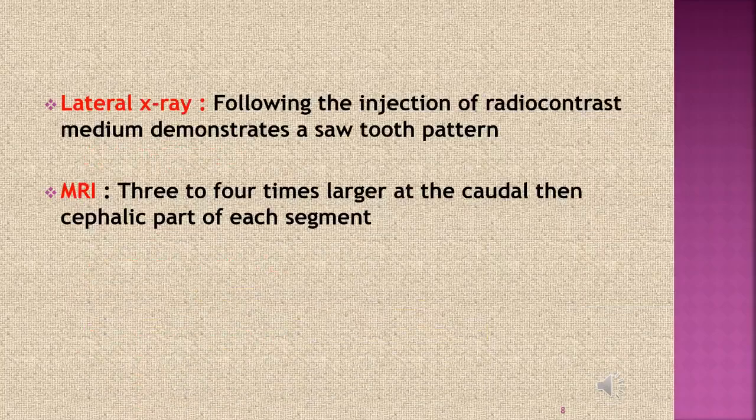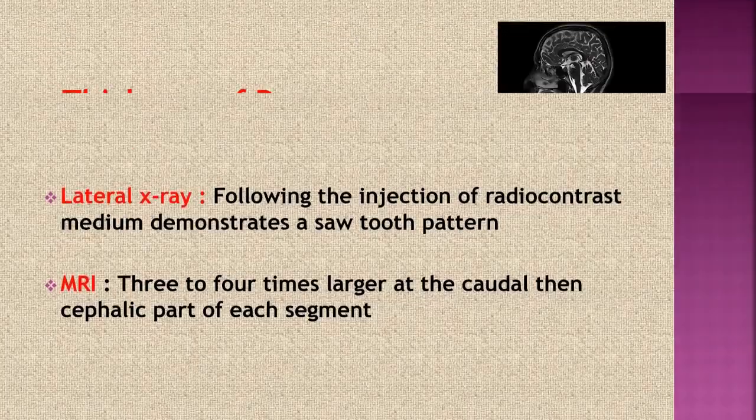Following the injection of radio contrast medium, when a lateral X-ray is taken, it has been found to demonstrate the sawtooth pattern of the space. When MRI is taken, it is found to be 3 to 4 times larger at the caudal than the cephalic part of each segment.